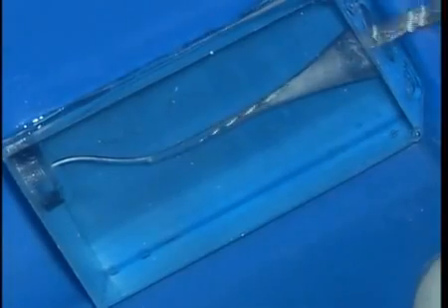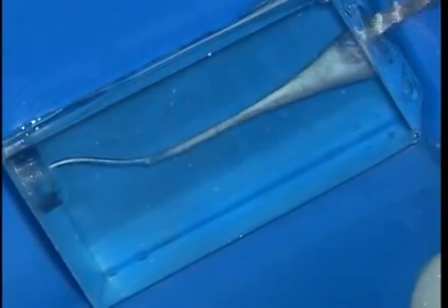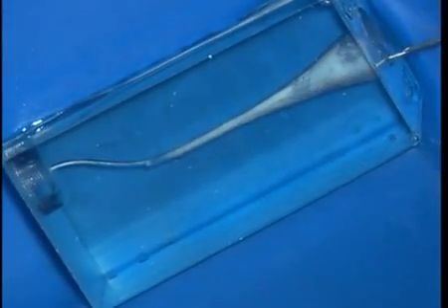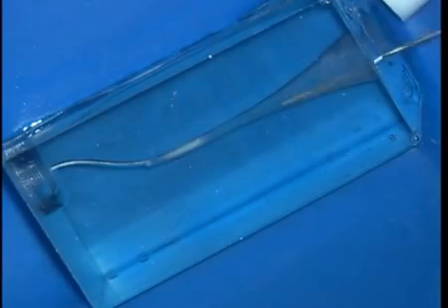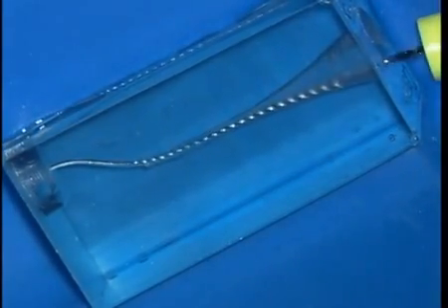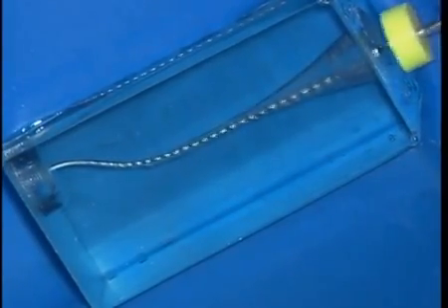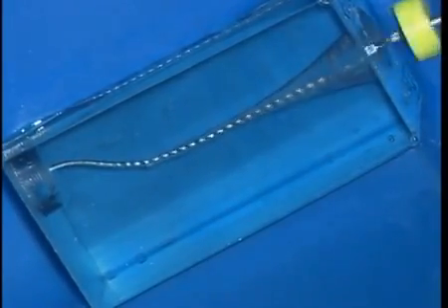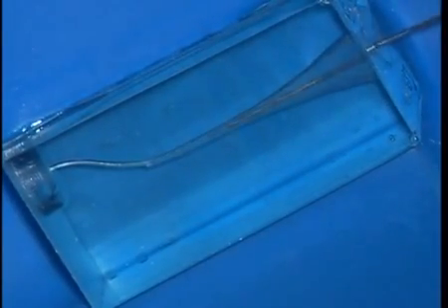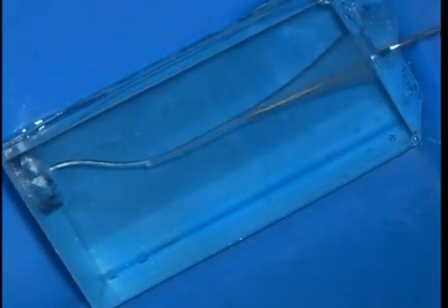We use a ProTaper Shaper 1 to flare and brush cut the coronal portion of the canal and improve access. This generates quite a bit of debris and necessitates continuous irrigation procedures after each rotary instrument. With improved access, the small pre-curved hand file is free now to go to length. It's worked repeatedly in short amplitude strokes until it is loose. Irrigate and recapitulate and re-irrigate.